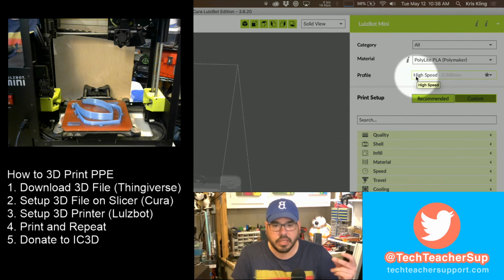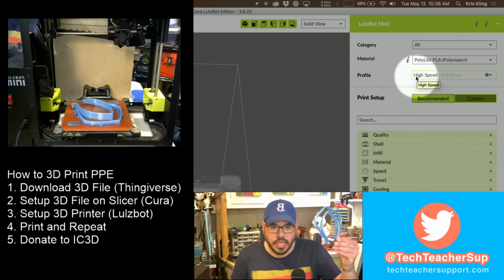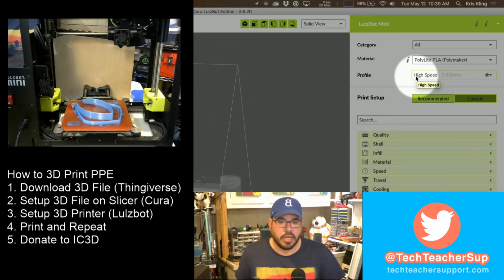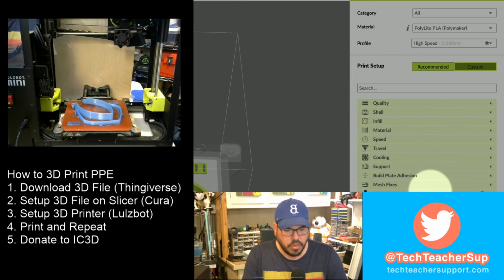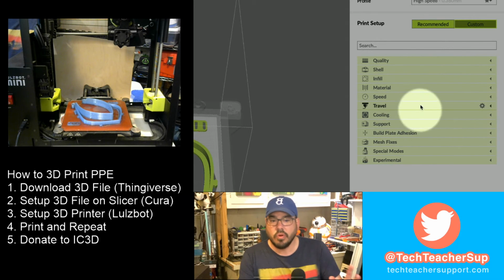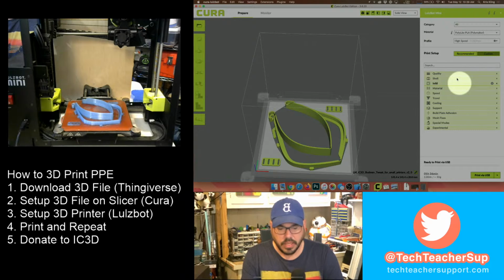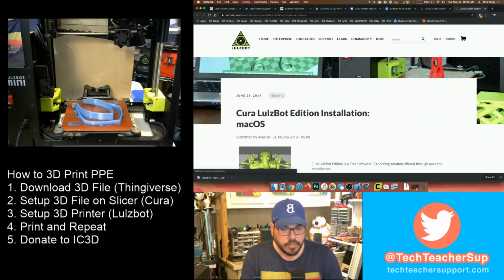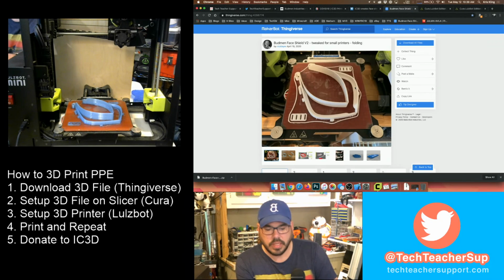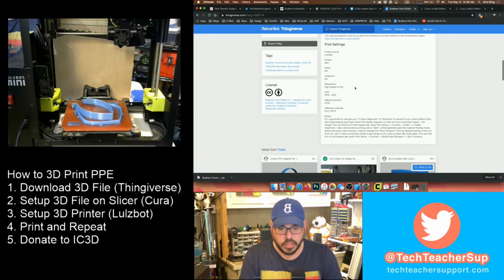So we want to get these out really fast. The detail is just fine on high speed, so the quicker the better, right? So we set that to high speed, and then you have a number of settings down here that you normally don't mess with. But real quick, I'm going to take you back to Thingiverse, and we're going to notice over here on Thingiverse that nickleye, the person who designed it, actually gave you a number of settings that you should use for your printer.